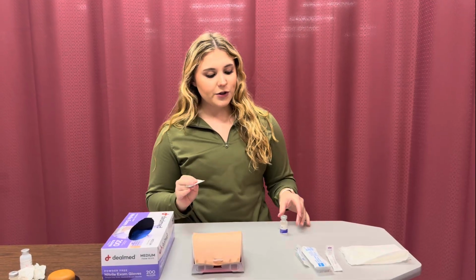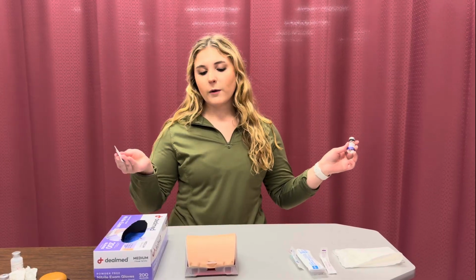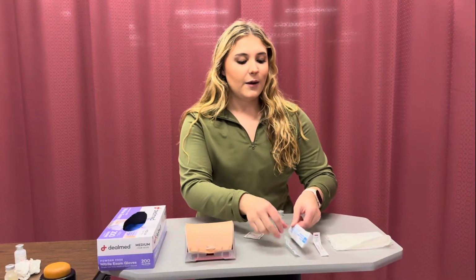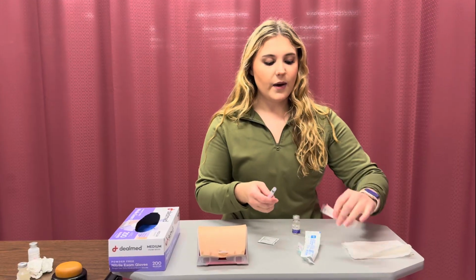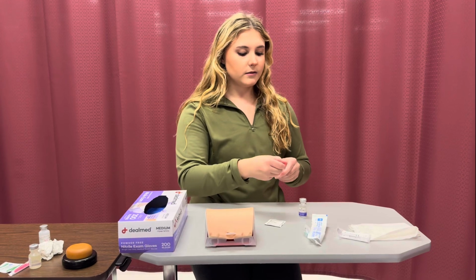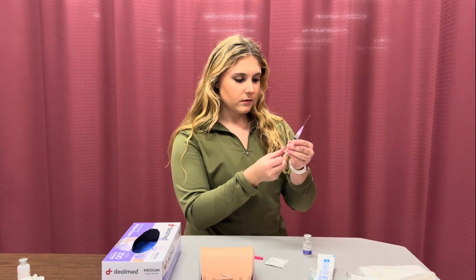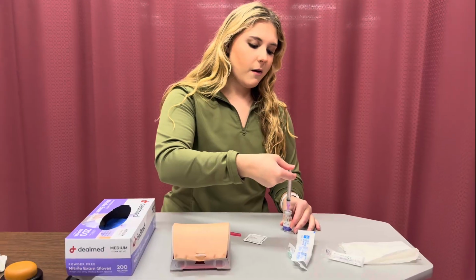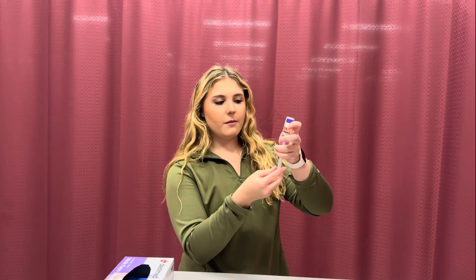After that, I would explain my procedure, saying I'm going to give you a 1 milliliter injection to your deltoid. Do you have a preference on which arm? We'll go right arm. Okay, perfect. So I'll clean off the top of my vial. We'll take my 3 milliliter syringe. Go ahead and apply my blunt needle. Okay. We'll draw back 1 milliliter in my syringe. Okay. And then draw back 1 milliliter of solution.